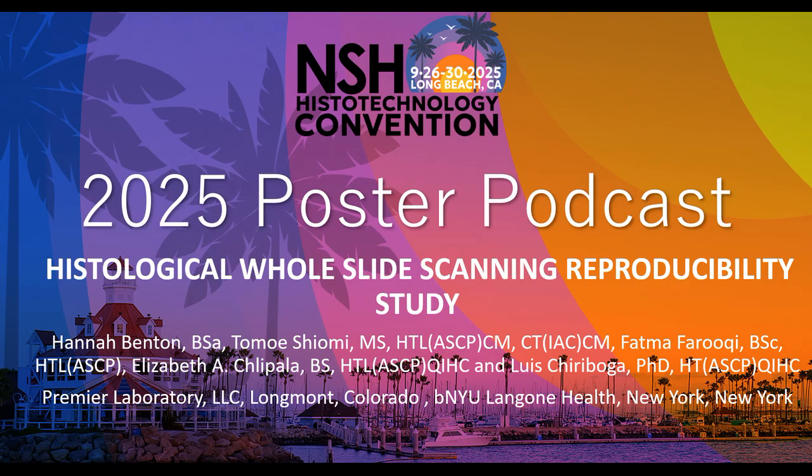Yeah, and I know one thing you talked about earlier for this was that fortunately you both have the same type of slide scanner, so for reproducibility studies, this is the best way to go. And it makes it work well for working across labs and sharing information. Yeah, absolutely. You can't compare two different scanners. The notion is that they're not going to behave the same way necessarily. So it was just kind of fortuitous that she had the same scanner that we did. And so, she understands how we do things.